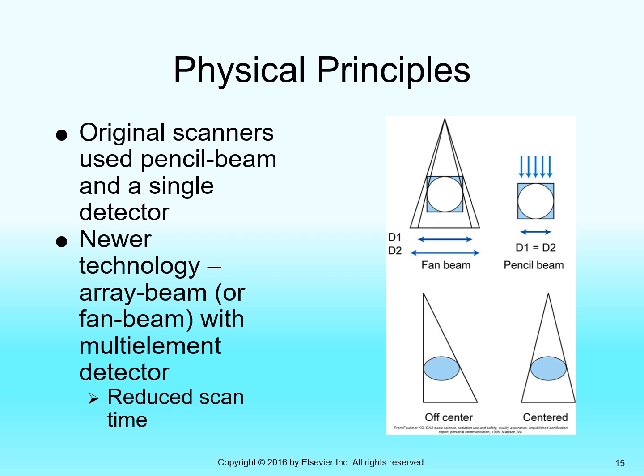Resolution, because the shape of the beam is still so small, we're not getting a lot of scatter generation. Therefore, we're getting high contrast resolution with these images. But again, the images are not the story for bone densitometry. The images are secondary. What matters is let's get a realistic score.